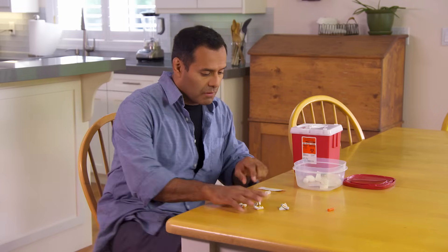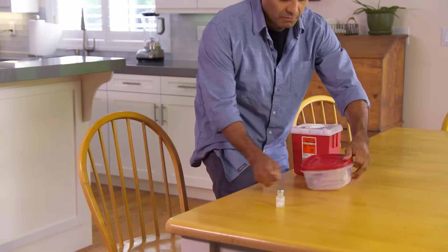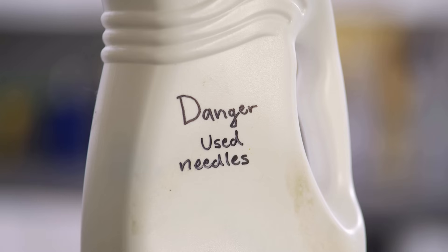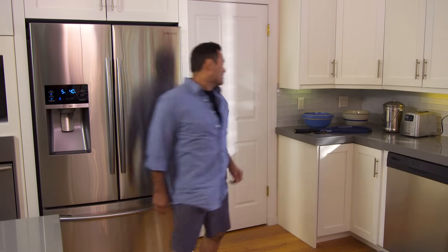Put the used syringe into a sharps container — it's easy to put needles in and hard for them to fall out. If you don't have a ready-made sharps container, you can make one using a jar or bottle made of stiff plastic with a screw-on cap, such as a detergent bottle. Label it very clearly as dangerous so anyone who sees it will know to leave it alone. Keep the container in a safe place, out of reach of children and pets. If your medicine needs to be refrigerated, put it back in the refrigerator. Everything else can be thrown out normally.